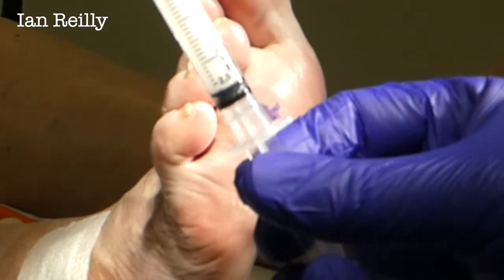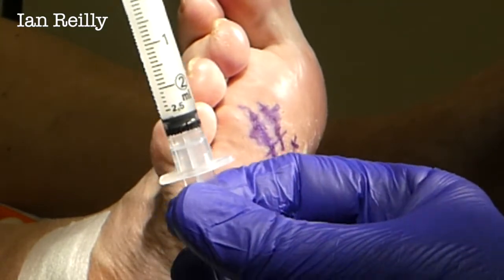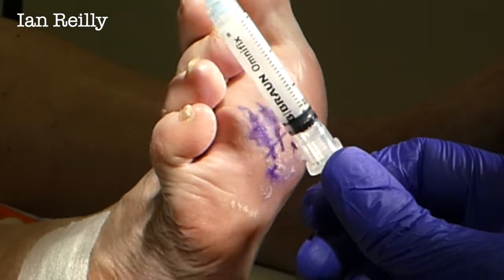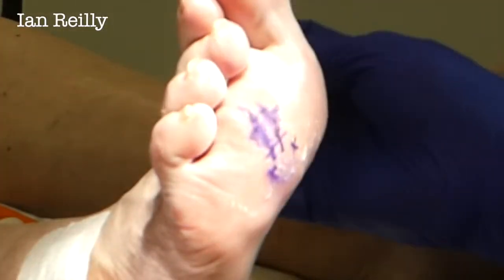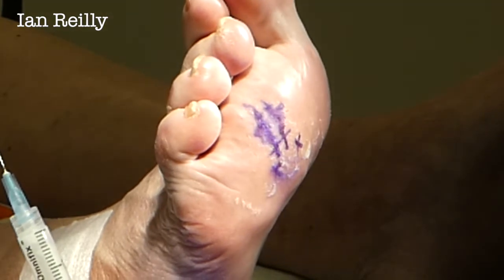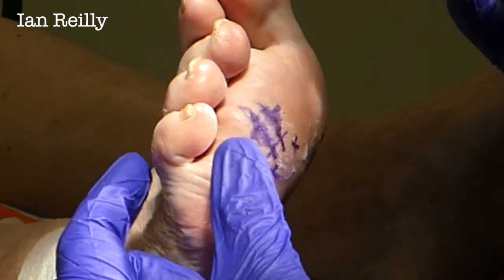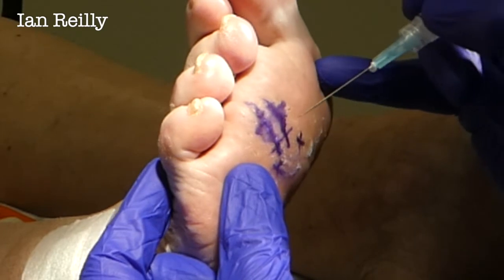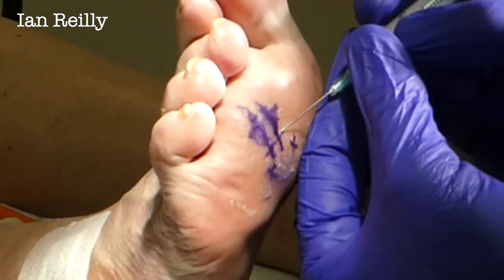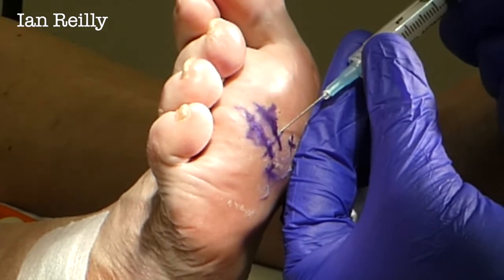Here's our Sculptra — we've drawn up about two and a half mils. It's quite goopy as you can see, but that's what we expect from a filler. We've just got a tiny little air pocket to take out, so we'll just get that out. Christine, you shouldn't feel any scratches at this point now — good, because that was sore wasn't it half an hour ago.